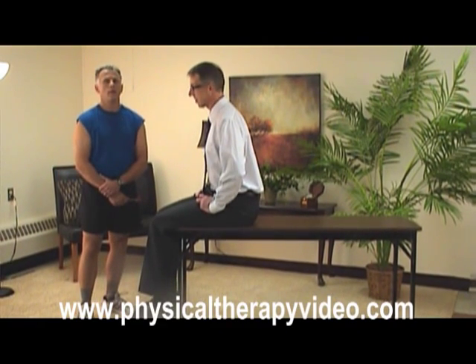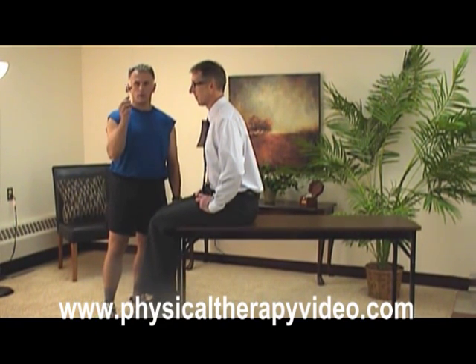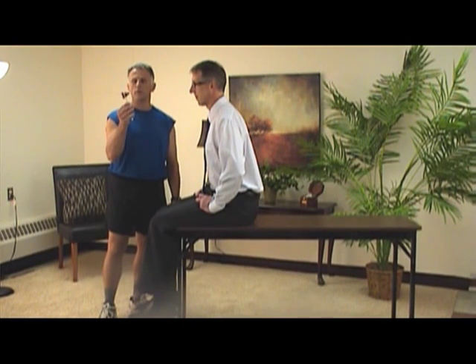Hi, my name is Brad Heineck, I'm a physical therapist. I'm Bob Schrupp and I'm a physical therapist. Today what we want to talk about is the simple little reflex hammer, and you'll see it all the time when you go into the doctor's office, and physical therapists use them as well.